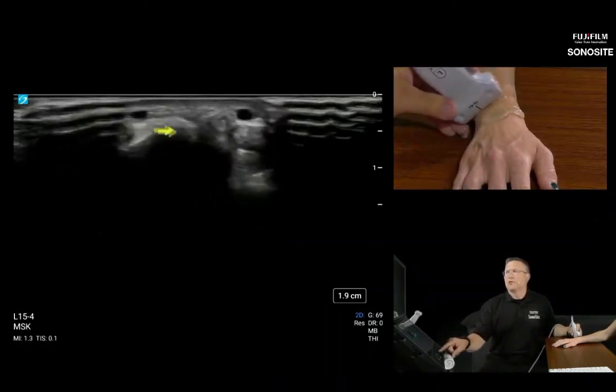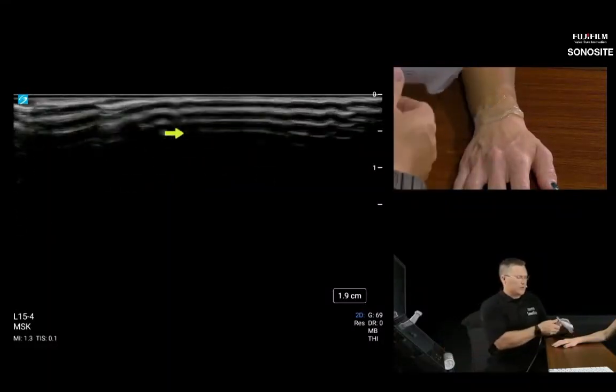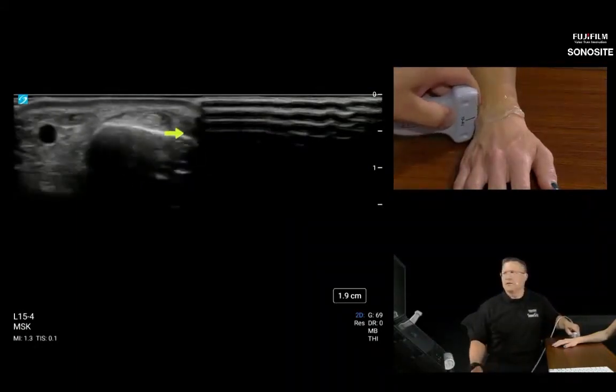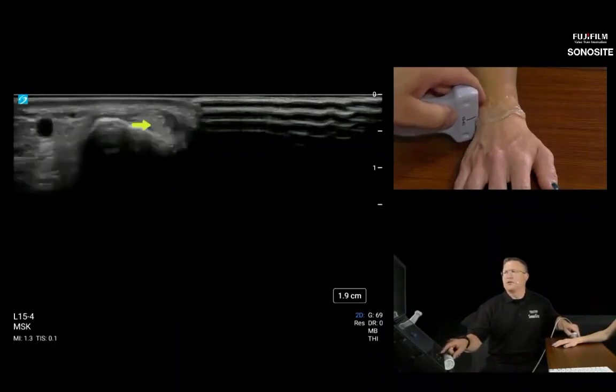And then we're going to roll over the ulna, not quite to the ulnar styloid, but one scanning tip, especially when we get to the smaller probe, is I'm just basically going to lay the probe down on the side of the table and fire into the ulna, and you're going to lay the probe right there on the ECU. So the extensor carpi ulnaris is right here.